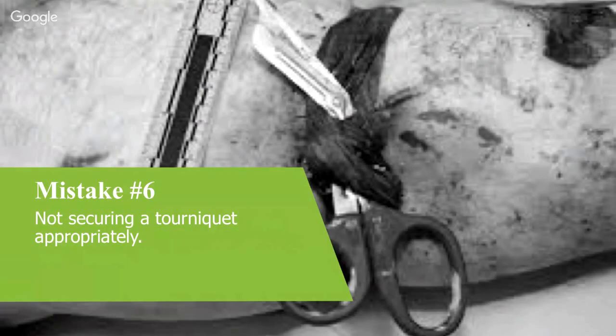Now, it might sound like a tough thing to have happen, but in the heat of the moment, when you've tourniqueted someone, you've tied it off, you're then looking to evacuate them, be that by a civilian platform, or in the military context, maybe AME. You've got a space blanket on them. Often you can't see that wound. You move them around a few times. People are bumping by them. There's a lot going on. There's lots of Velcro on military uniforms that can catch the tail of a CAT, and the Velcro strap, the loose end, can get pulled open. You lose all your tension.